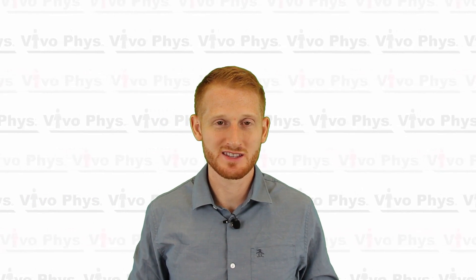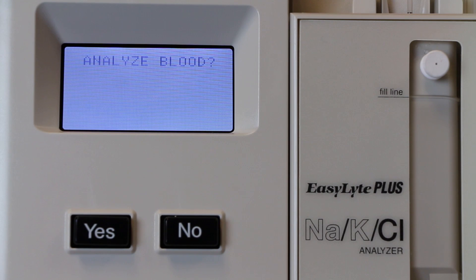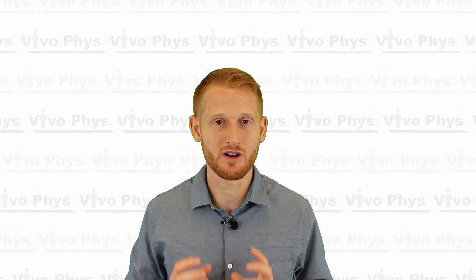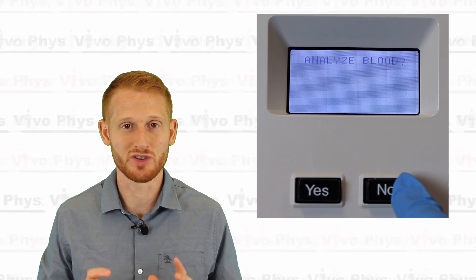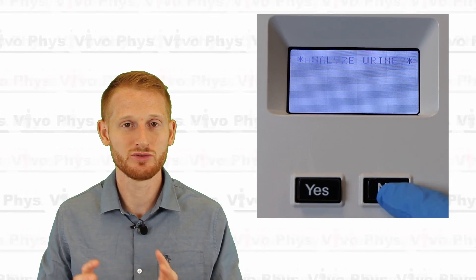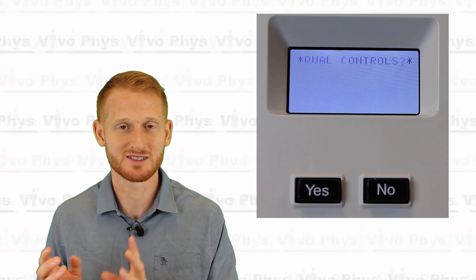Once it's done calibrating, it's going to bring up the option to analyze a blood sample. Before you do that, if the machine hasn't been tested for quality control recently, you'll want to run a quality control — it should be run every day, or at the very least every week. Go through the selection options using the yes or no buttons. Hit no until you see the second screen, hit yes on second screen, and then hit no until it gets to quality control.